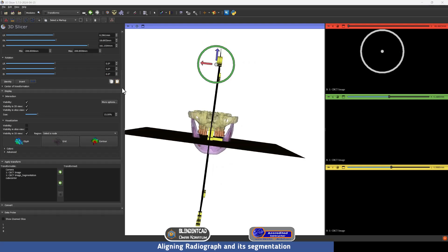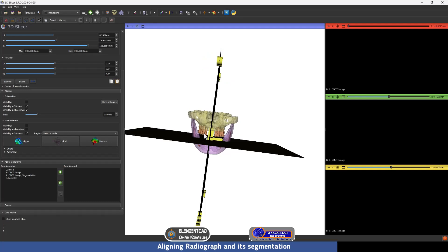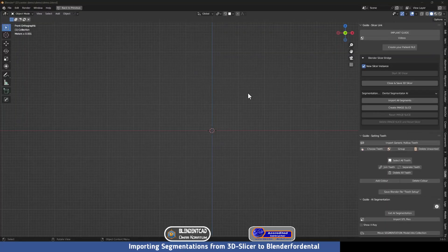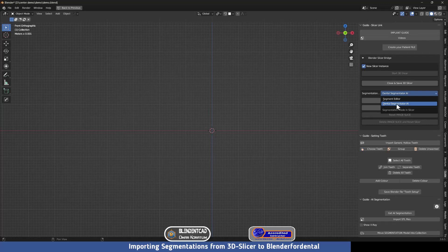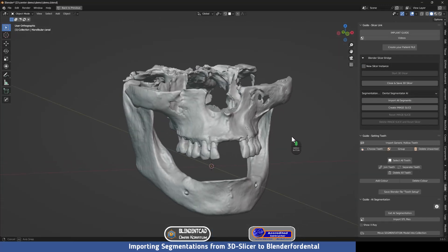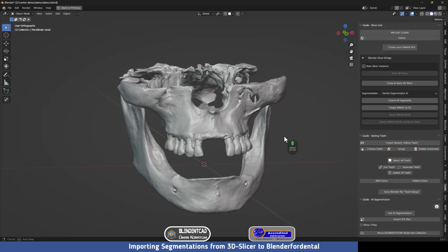Now we can disable this transform gizmo by pressing Visibility again, and we are ready to import the segmentation to Blender for Dental. Now back in Blender for Dental, to import the segmentation — take care: if you are using Dental Segmentator AI, you have to use the Segmentation mode. If you have done manual segmentation, choose the Segment Editor option. Since we used Dental Segmentator, we keep this option and press Import All Segments.